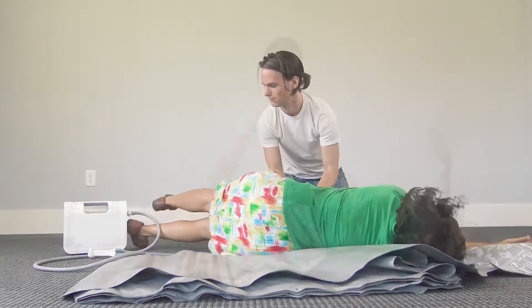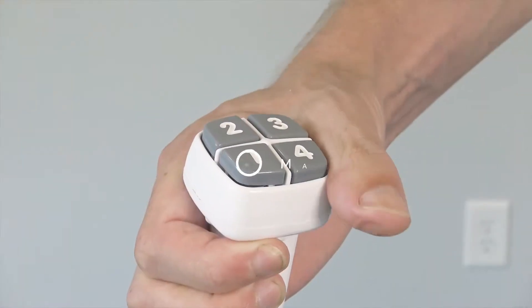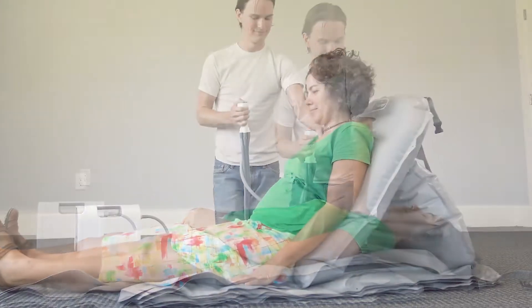Help the patient into a lying position on top of the Camel, using one hand to support the patient and the other hand to hold the control. Press and hold the number one on the control to partially inflate the backrest until the patient is in a comfortable position.